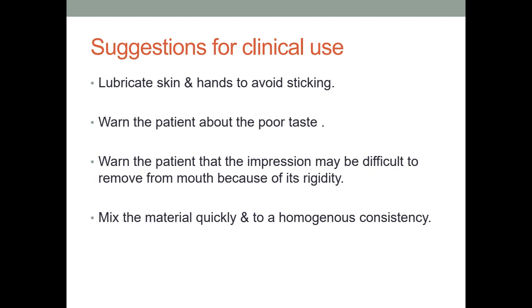So whenever you have a periodontally compromised condition, it is very important to block out those gaps with the help of a blocking material like wax, or some other material which is compatible in the patient's mouth, and then you can make the impression.